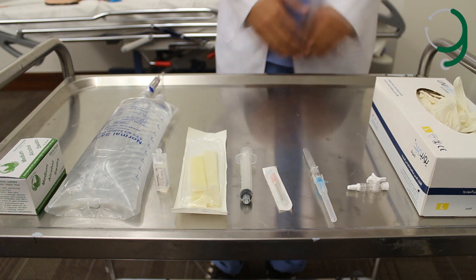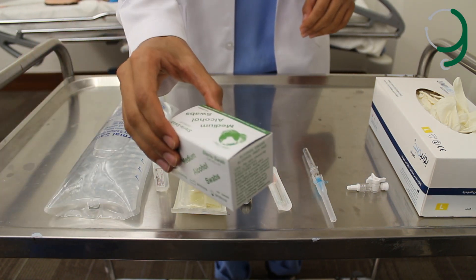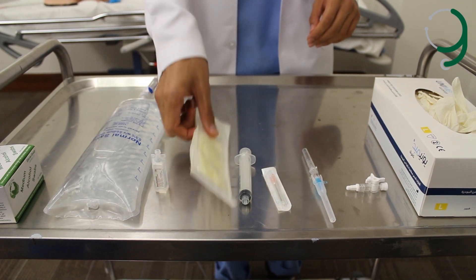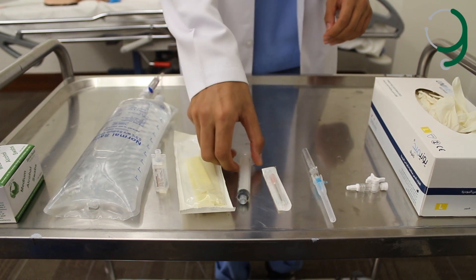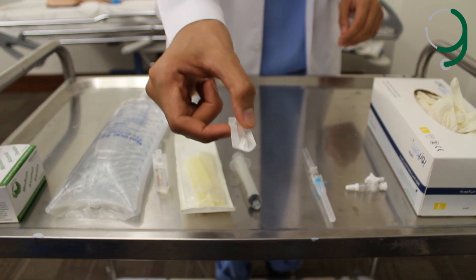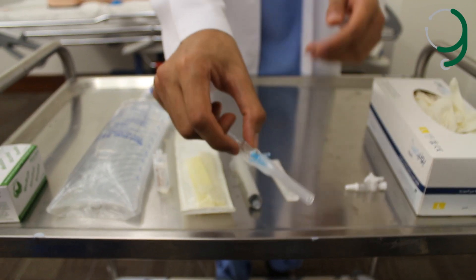Here's the equipment. We have alcohol swabs, normal saline, tourniquet, syringe, needle, and the cannula.